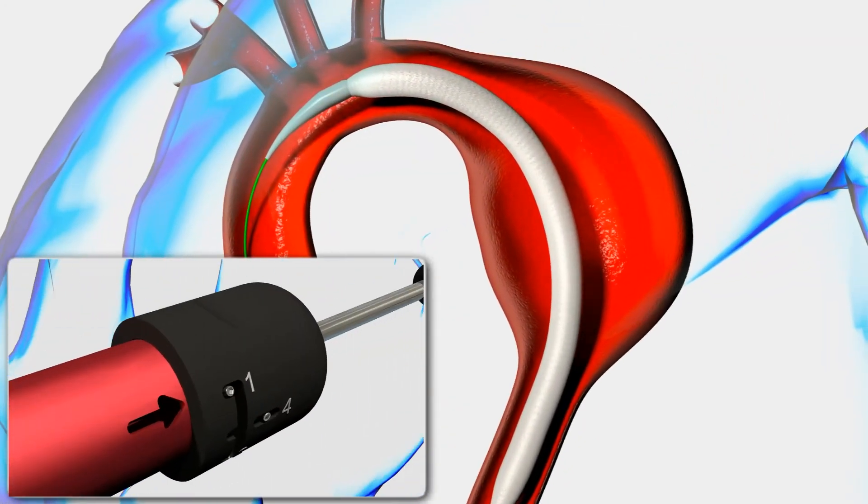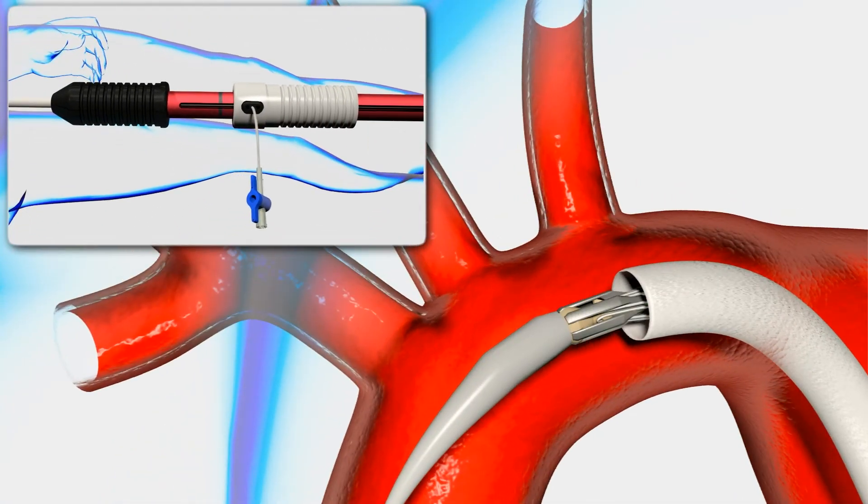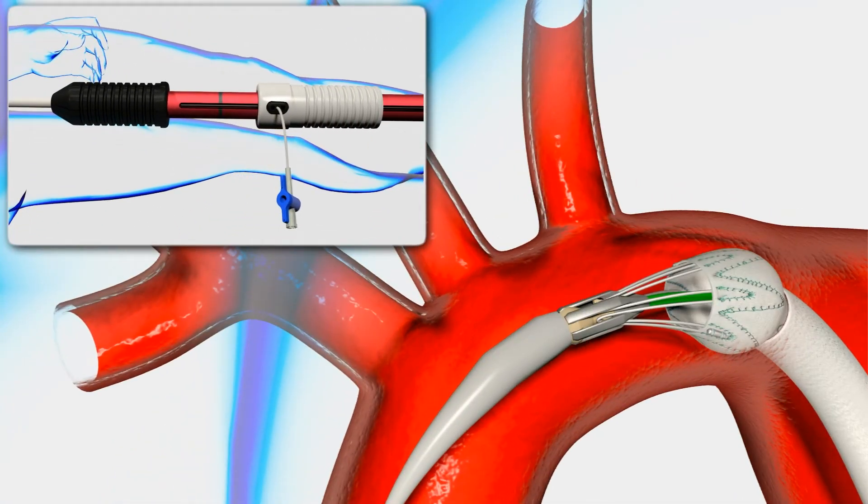Rotate the controller to position 2. Retract the gray deployment grip to uncover the bare and first covered stent.